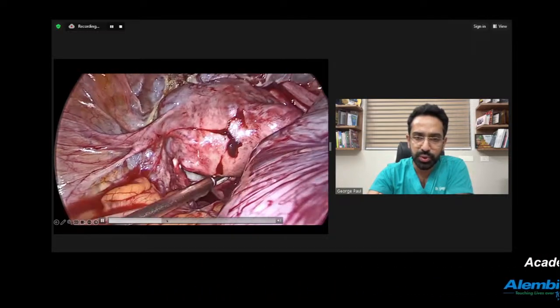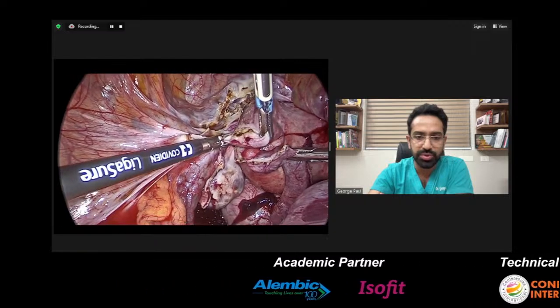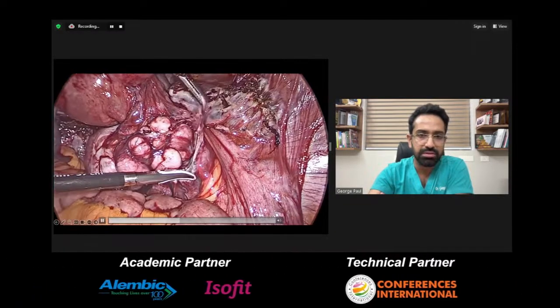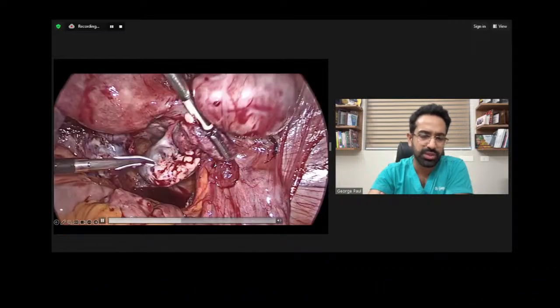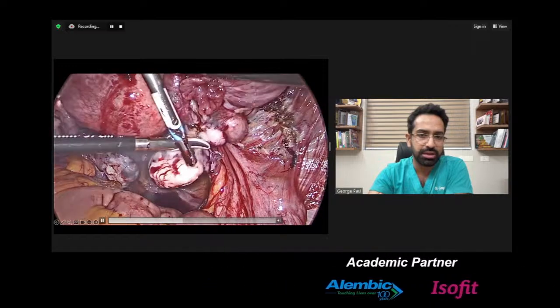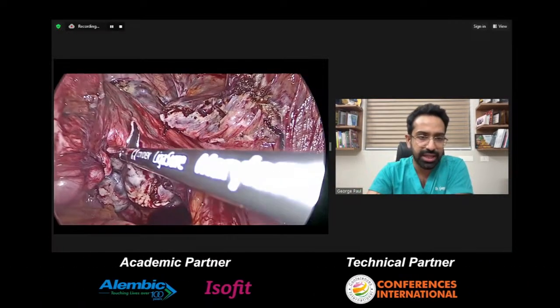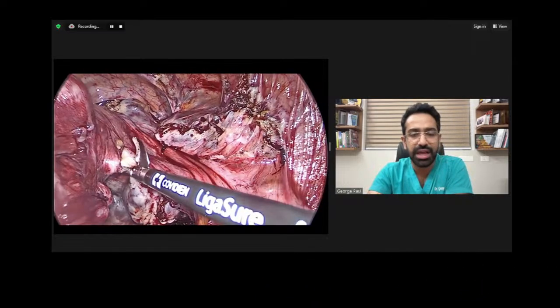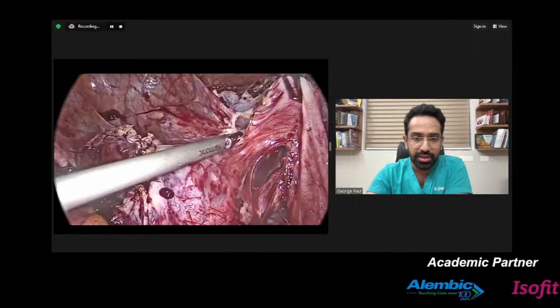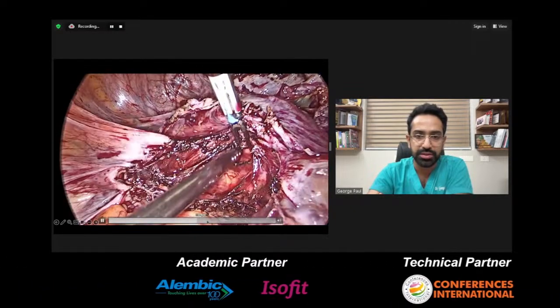So this patient, we were doing a hysterectomy as well. So we went the same way. Hysterectomy was pretty much straightforward. Again, you can see a bunch of grape-like myomas hanging from the uterus as well. It's not that all patients would have this, but it's sort of an inborn tendency that the patient might have, and some of these patients might even have the pathology come as cellular leiomyoma as well. Those are the ones which have a higher tendency of parasitic myomas.